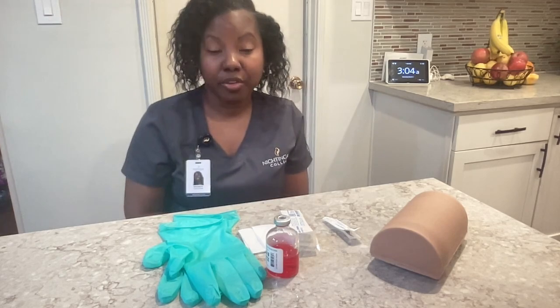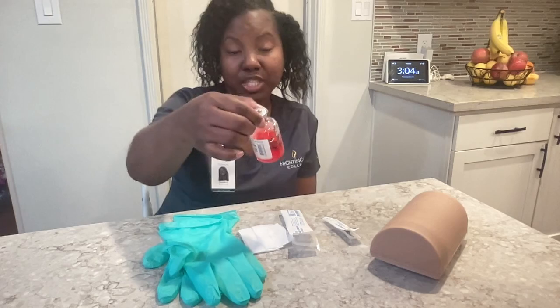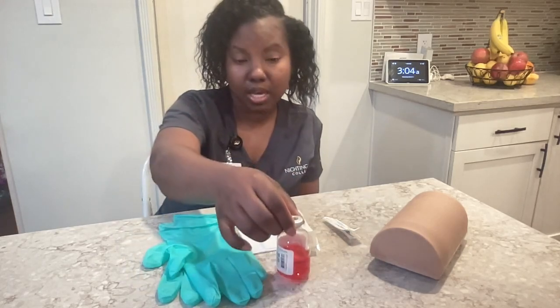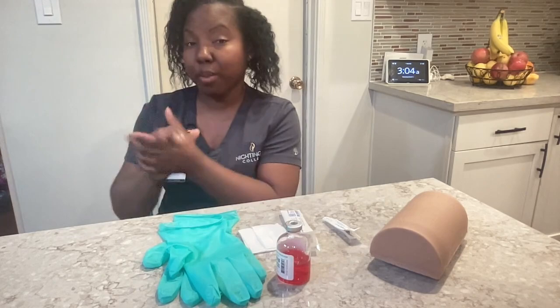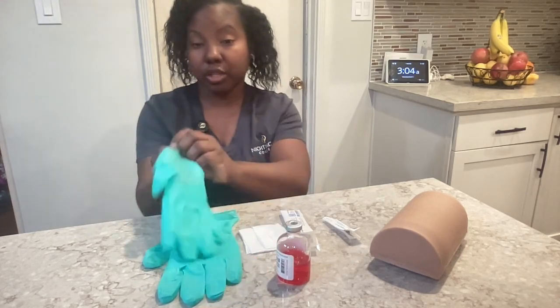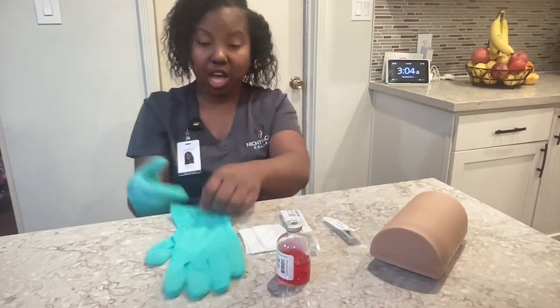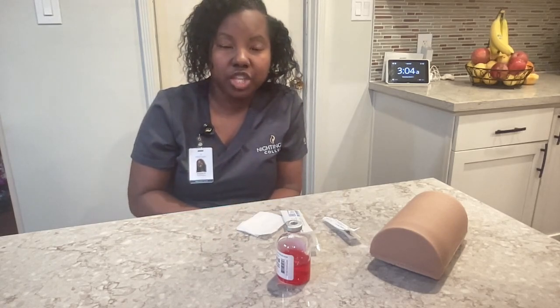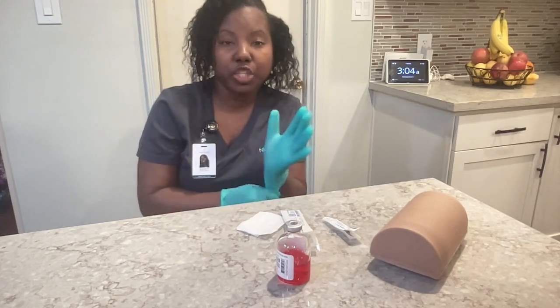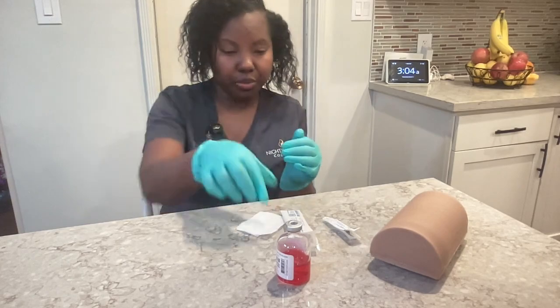I am about to prepare the injection. I am going to double check the medicine one more time against the MAR. I am going to perform hand hygiene and put on gloves. For today's injection, I will be using a three milliliter syringe with a 22 gauge by one inch needle.